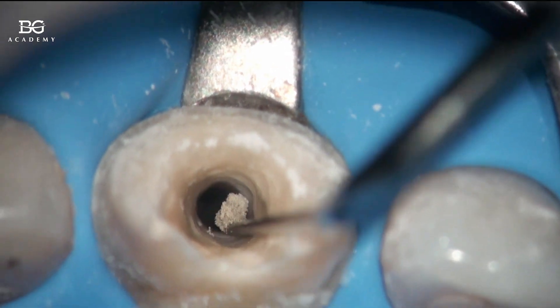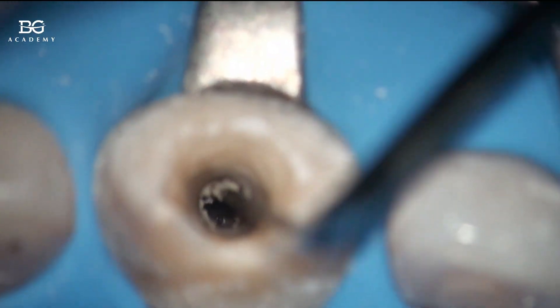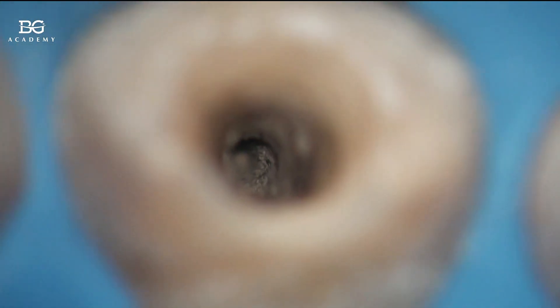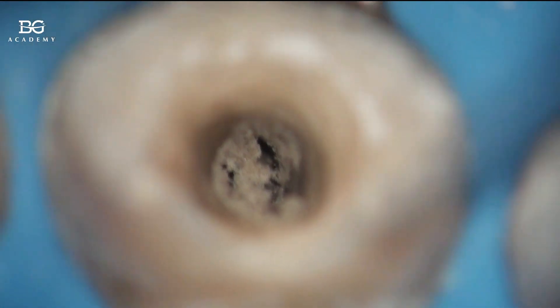The first portion of MTA in the open apex — in case you see the periodontium — we place without any mixing. Basically, it's dry, complete powder of the MTA. When you place it down to the apex, it will get some moisture from the periodontium itself, and it will get this liquid to set properly.